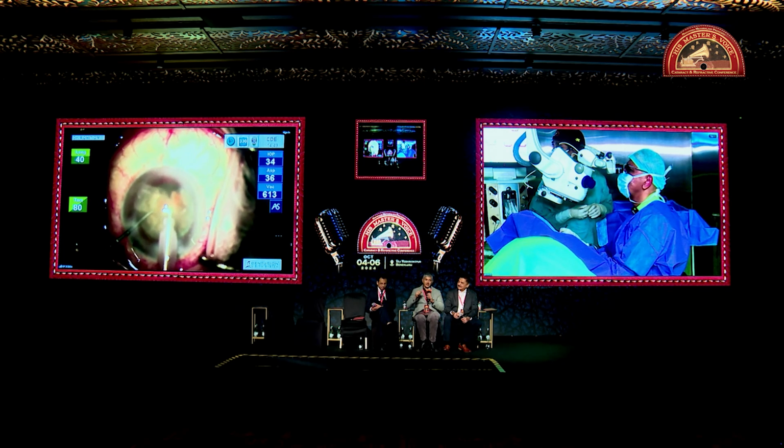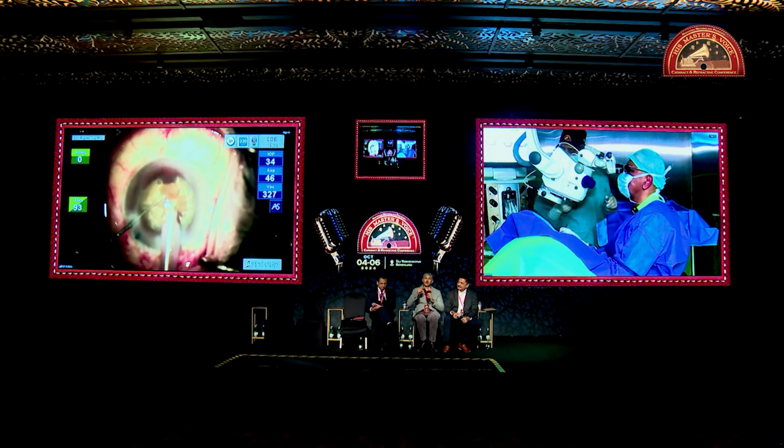So you have to impale the tip. You cannot hold with vacuum.